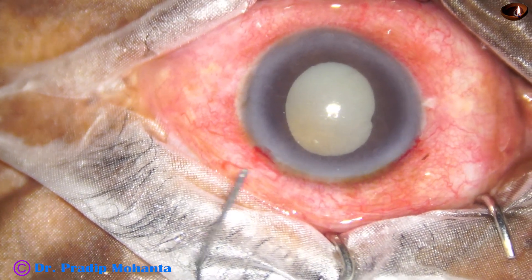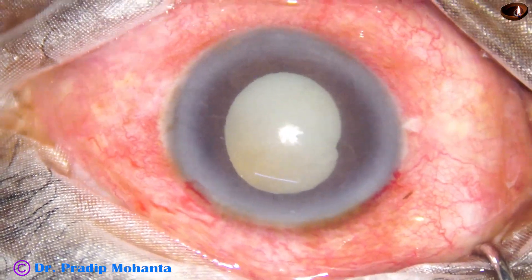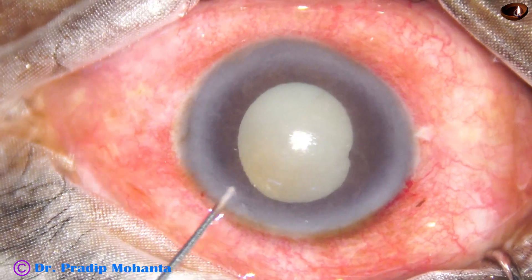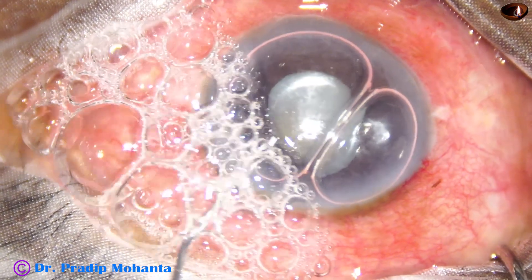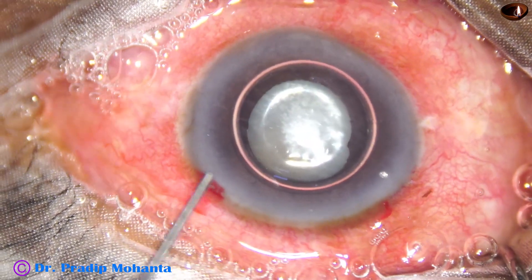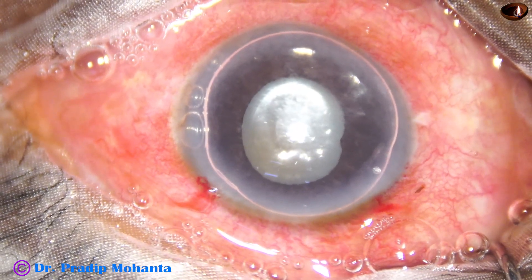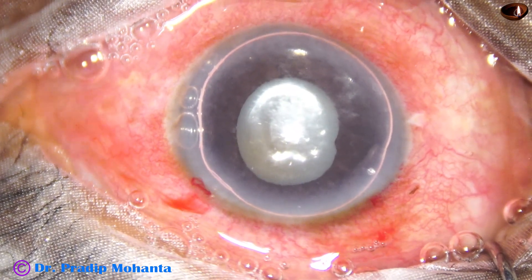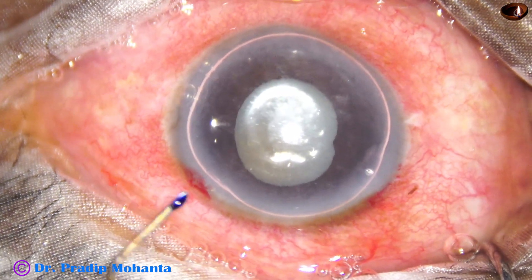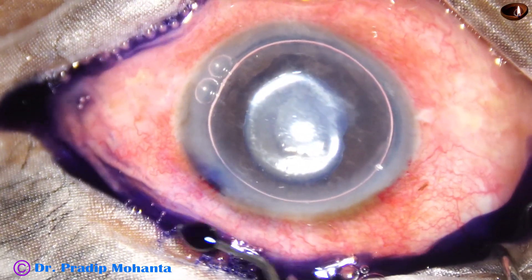Now, how to stain this capsule with trypan blue dye? Without an air bubble you can, but you have to wait for a minute. If you inject the trypan blue dye underneath an air bubble, the dye is not diluted by aqueous — it sits on the anterior capsule immediately and the staining is immediate.